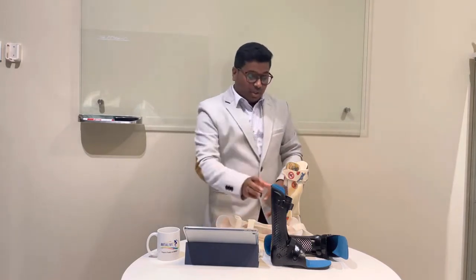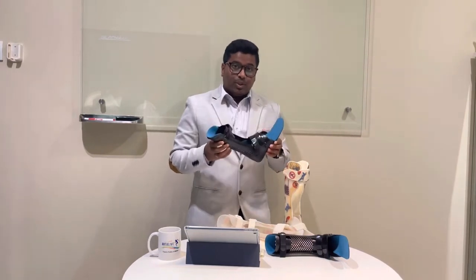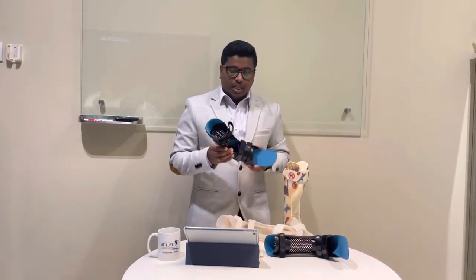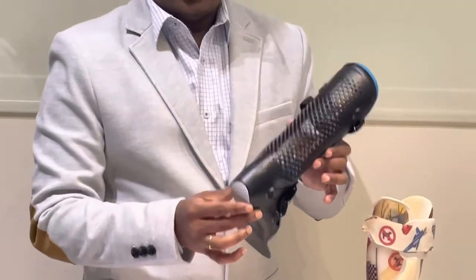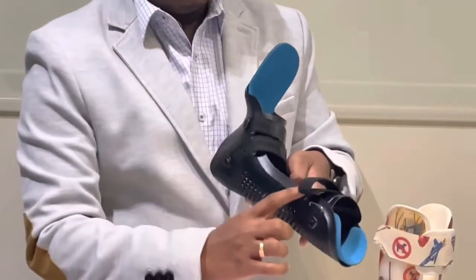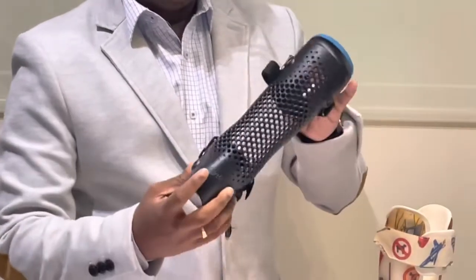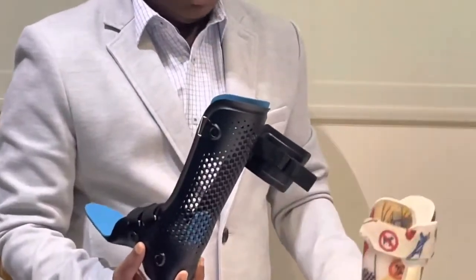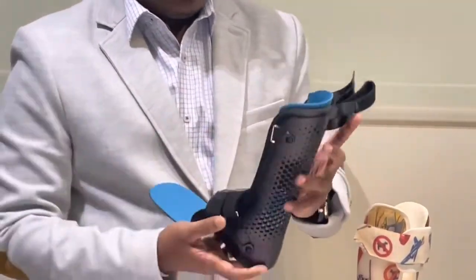Now I'm going to tell you about a wonderful AFO — the 3D printed AFO, which Artha Life is introducing for the first time in Malaysia. This is imported from Czech Republic. The 3D printed AFO is very light in weight — it is the lightest and the thinnest AFO available.